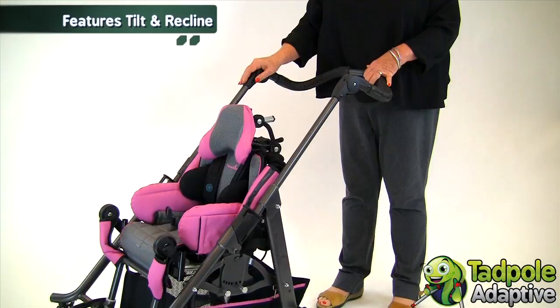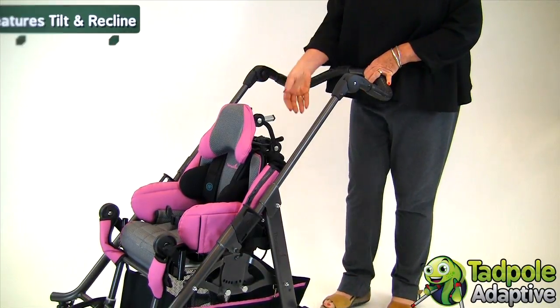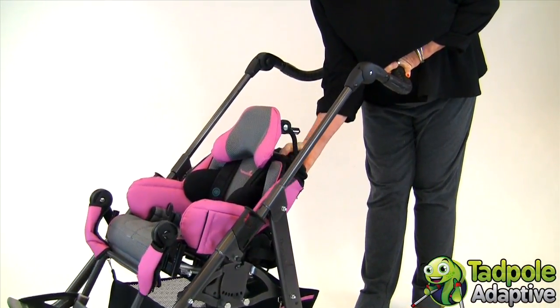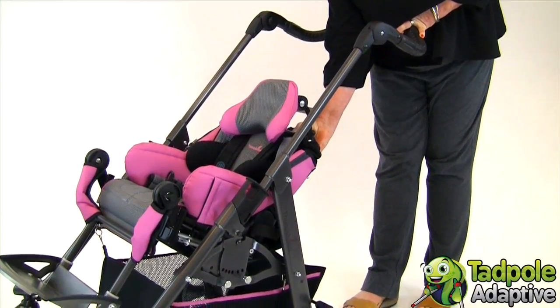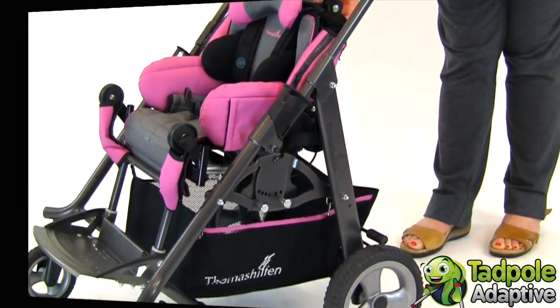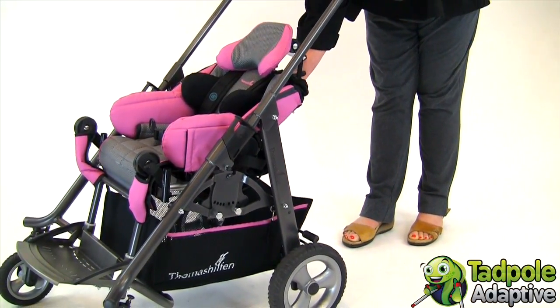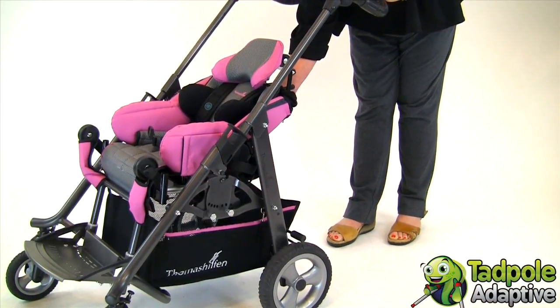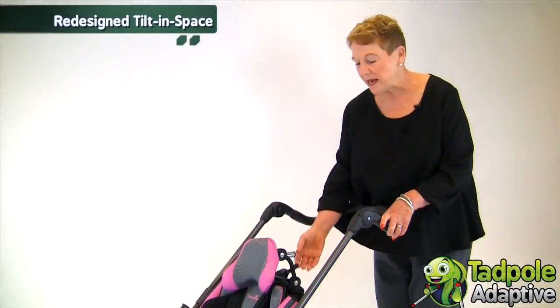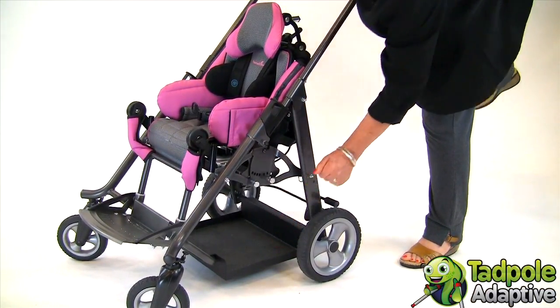With T-Ride, you can position a child for independent function or rest using the tilt and the recline. The tilt is a simple hand function located right at the top of the headrest bracket. The tilt in space goes from 10 degrees anterior to 35 degrees posterior. The recline is a separate function from a simple mechanism at the base, and you can go from 90 degrees to 140 degrees of back recline. With the redesign of our tilt and space mechanism on T-Ride, we've increased the space below the seat to carry medical equipment, shown here with our vent tray beneath the seat.